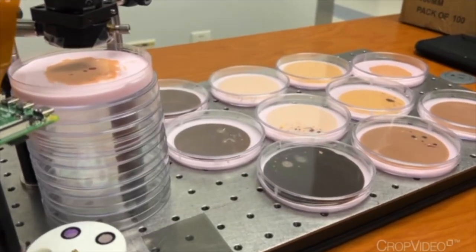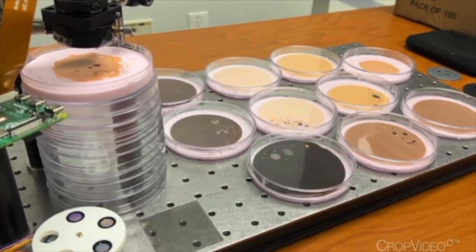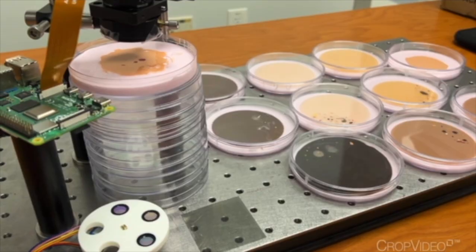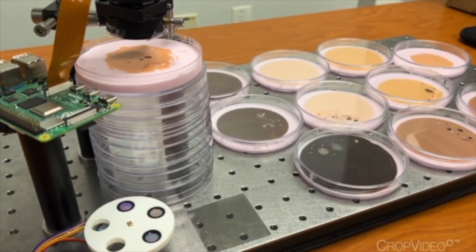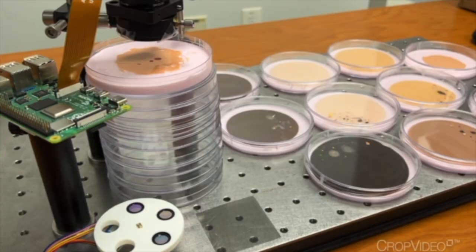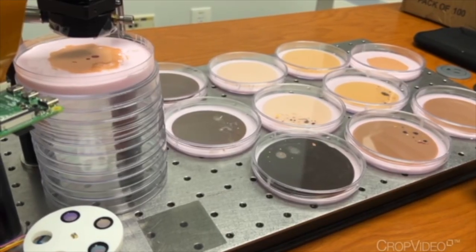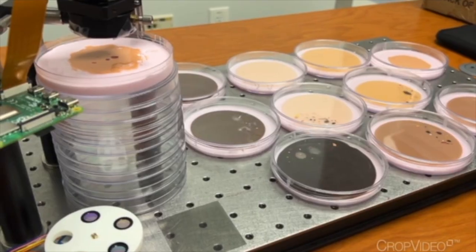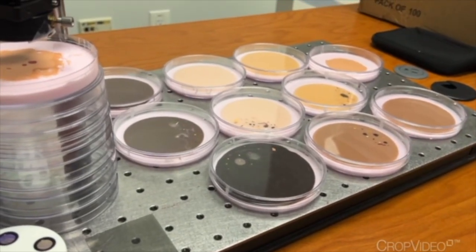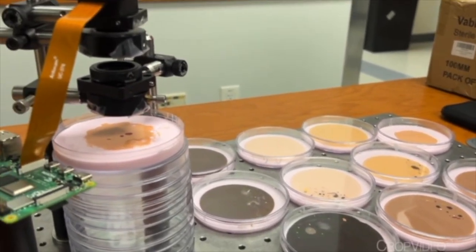We first measured clear silicone samples to establish a baseline for absorption before adding pigments and scattering agents. The pigment and titanium dioxide levels were then fine-tuned until each phantom visually matched the appearance and optical depth expected for its intended skin tone. The collected images allowed us to observe differences in brightness, color, and contrast across different skin tones and wavelengths, as well as how deeper features became more visible under near infrared illumination. These phantoms now serve as a controlled test platform for the next phase of analysis, where we will calculate the scattering coefficient and absorption coefficient and the spatial resolution of the imaging system that we have here before moving on to testing with live subjects.